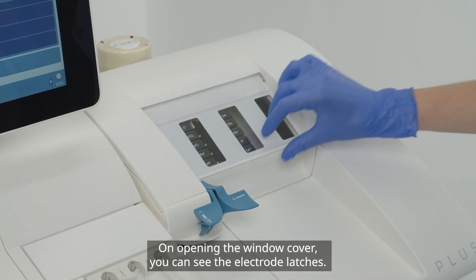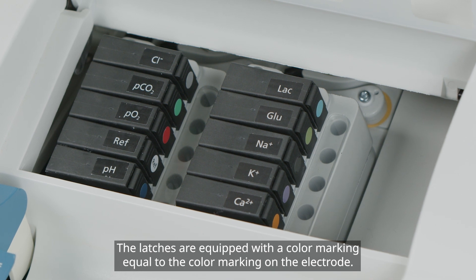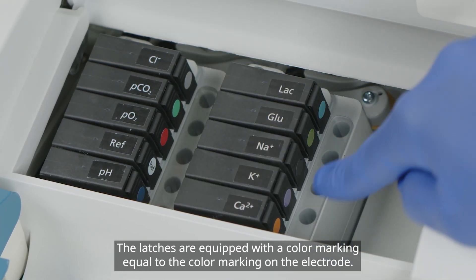On opening the window cover, you can see the electrode latches. The latches are equipped with a color marking equal to the color marking on the electrode.